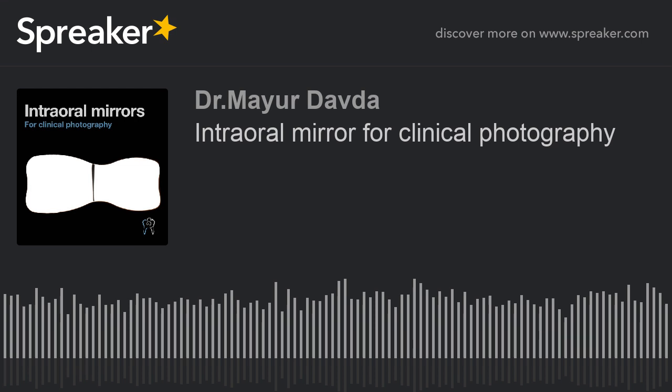So these are the primary criteria. Now let us look at some secondary criteria. If your mirror has a coating of zirconia or chromium, it's said that those mirrors are good. This is primarily because the reflectivity of zirconia coated, chromium coated, or sometimes even titanium coated mirrors is extremely high. But the drawback of this is that whenever a mirror surface is coated, the mirror becomes extremely expensive. If it fits your budget, you can go ahead with coated mirrors.